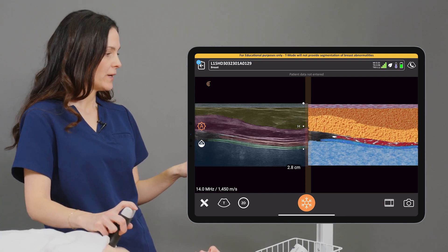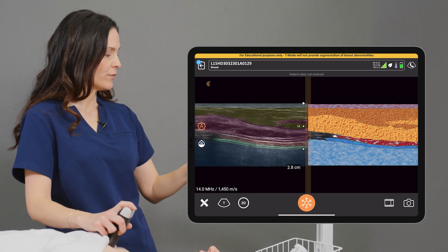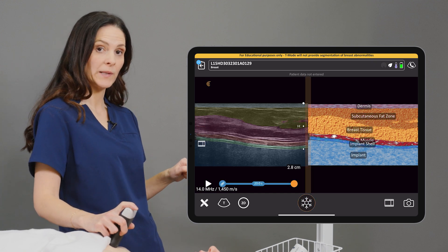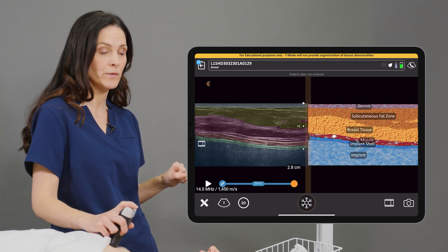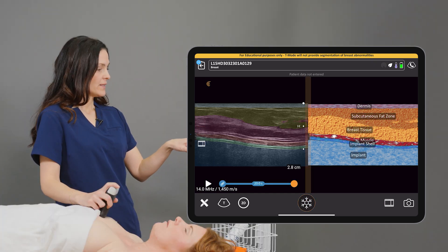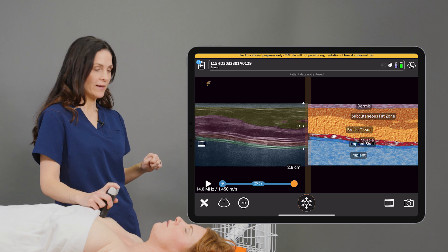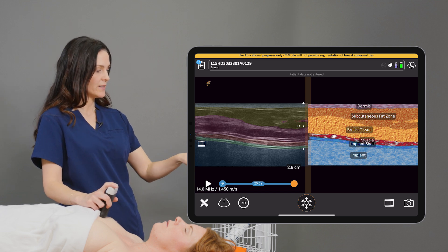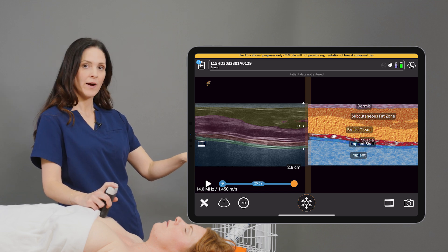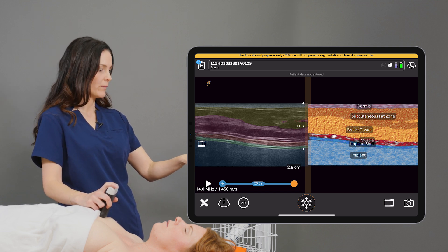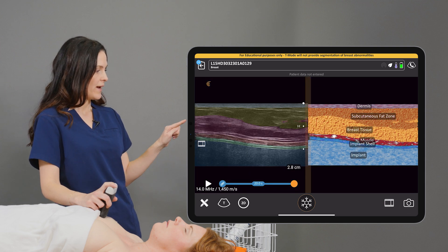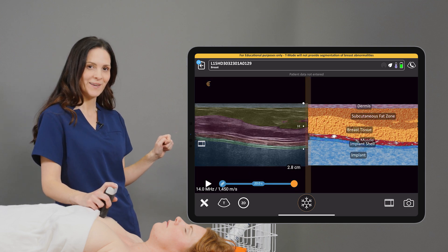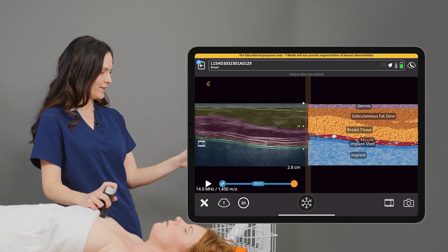Once I'm happy with the look of my image, I can freeze the image, and the text labels are placed on the T-Mode display. This includes breast implants. When I'm ready to save my image, I can select the camera icon on the bottom right-hand side of the screen, and the image along with the text labels are transferred to the Clarius Cloud.